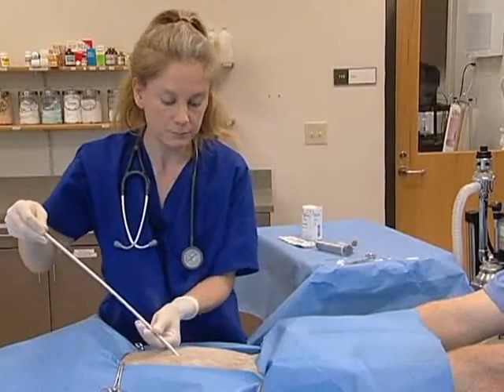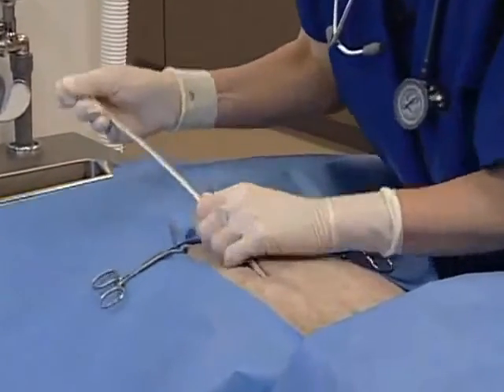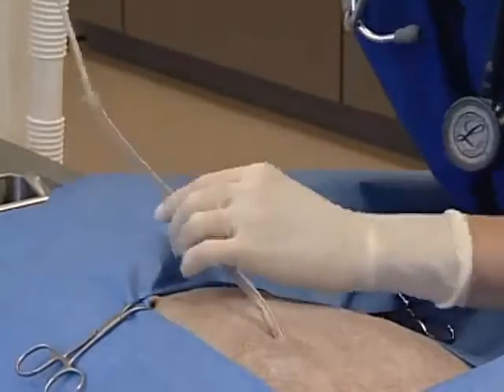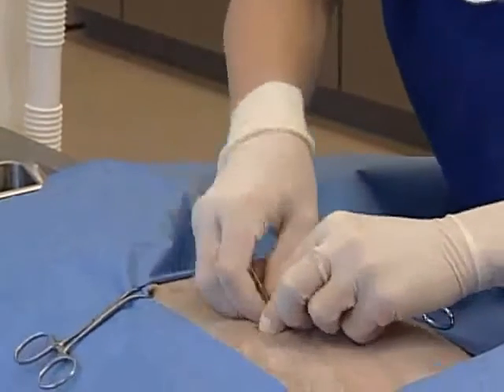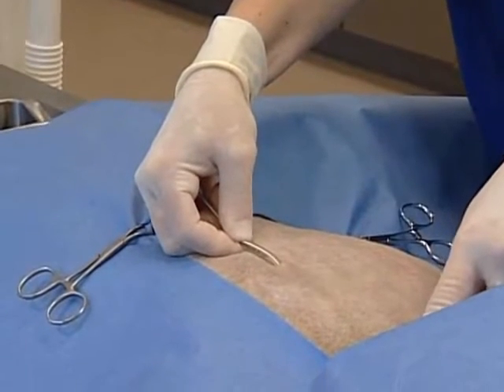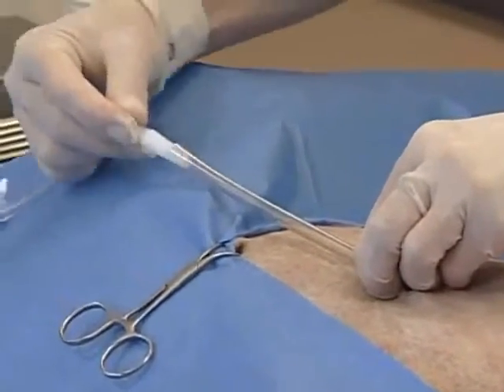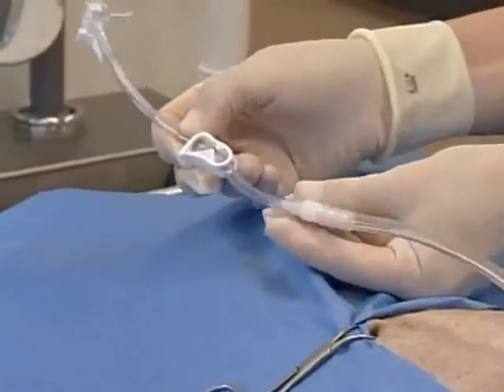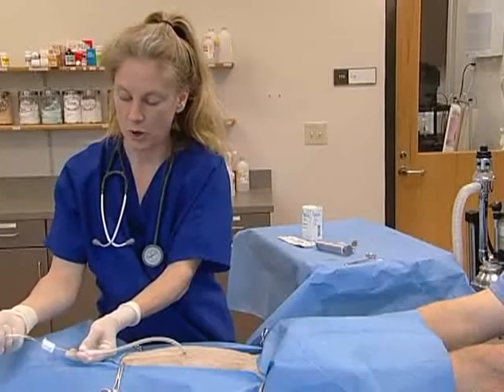Once you're inserted into the pleural cavity, advance the chest tube and slide it off the trocar, clamping the chest tube as you go to prevent the insertion of air. Insert the chest tube until the distal part is about the second or third rib space. With the chest tube clamped, take a chest tube adapter and insert it into the back of the chest tube. The chest tube adapter comprises a Christmas tree tubing, a C-clamp, and a three-way stopcock at the end, which is turned off towards the patient.